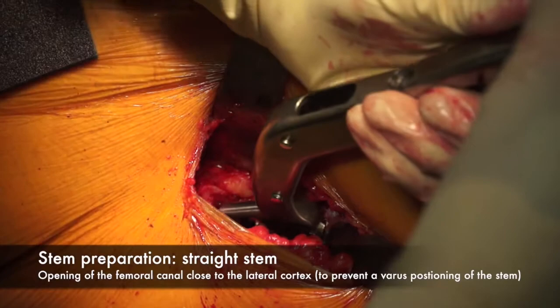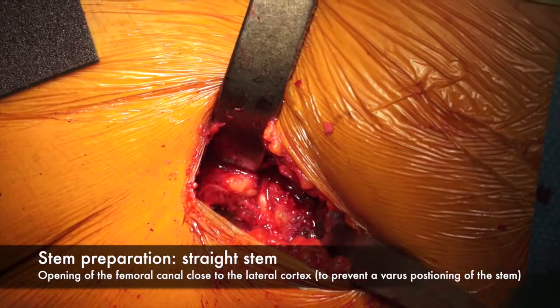Stem preparation. Straight stem. Opening of the femoral canal close to the lateral cortex to prevent a varus positioning of the stem.